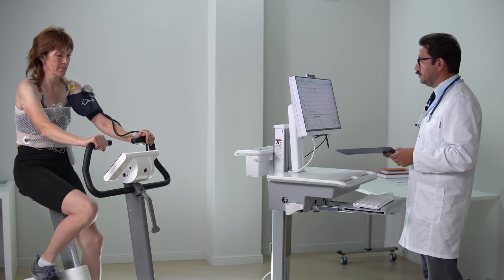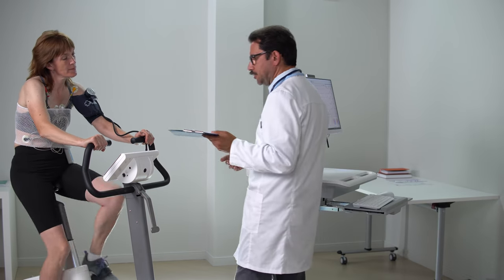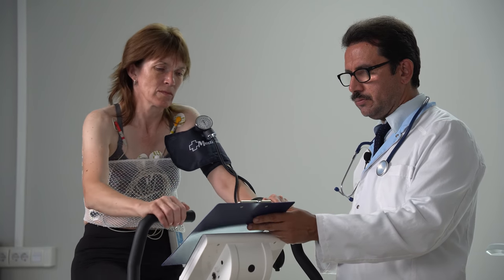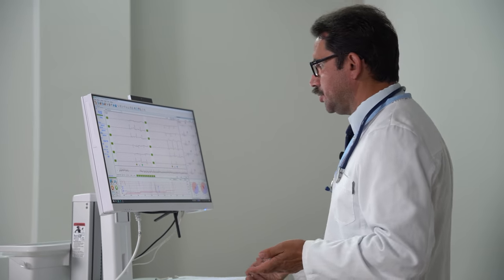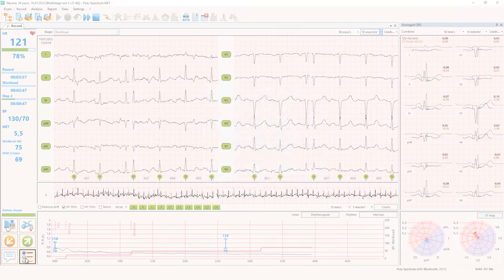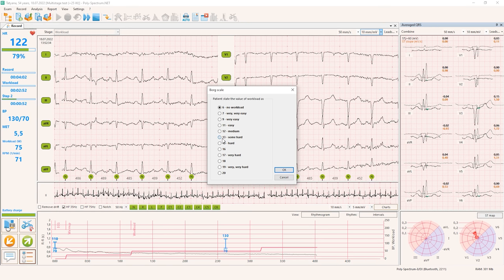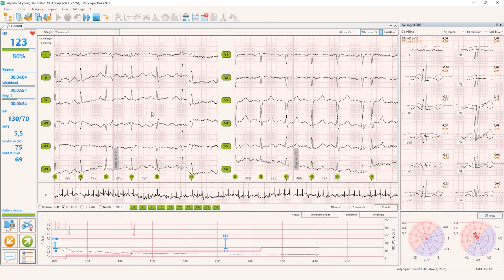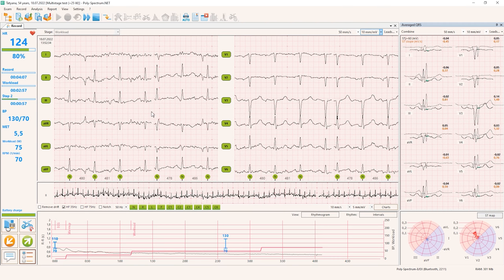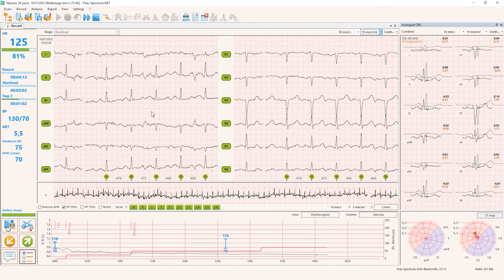And for sure, on every stage or every second stage, you should come to the patient and ask what the load looks like. Here is a colored scheme, and you can have the answer. The software has a special field where you can input data, and this data is saved in the recording and you can check it next time.